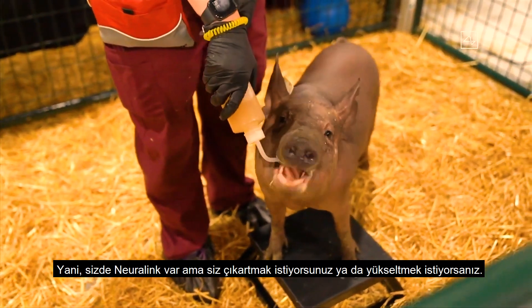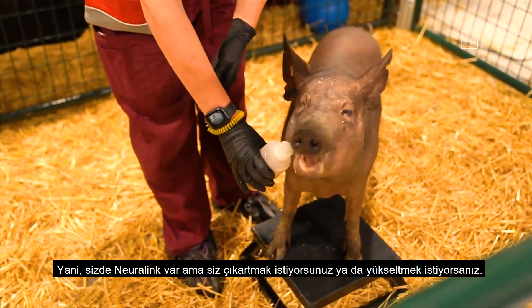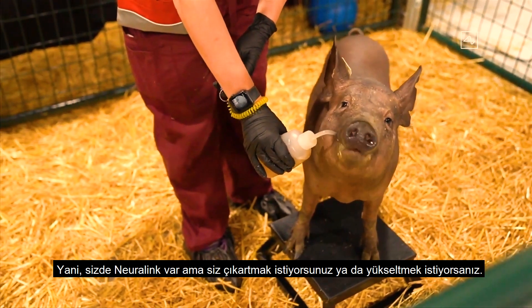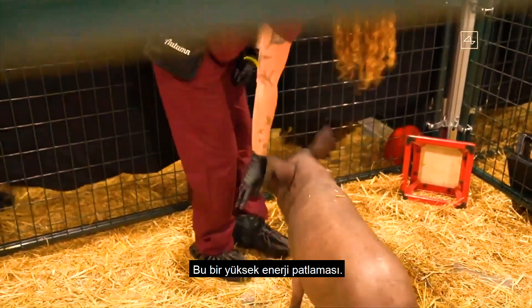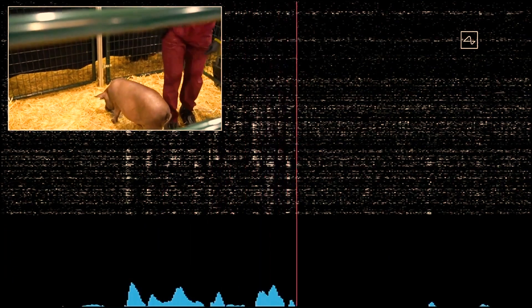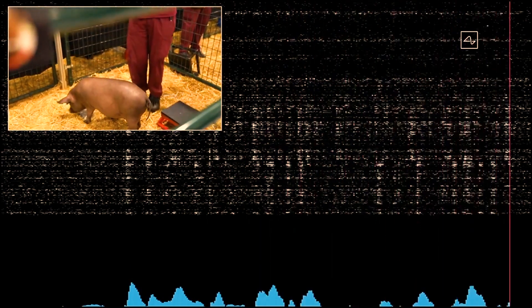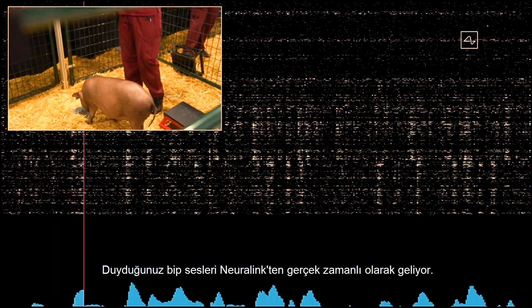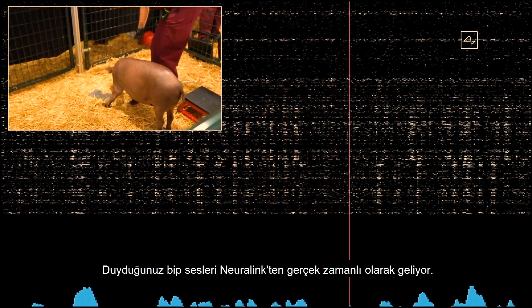If you have a Neuralink and then you decide you don't want it, or you want to get an upgrade and the Neuralink is removed — is it removed in such a way that you are still healthy and happy afterwards? This is a high energy pig. Gertrude, thanks for coming out. The beeps you're hearing are real-time signals from the Neuralink in Gertrude's head.